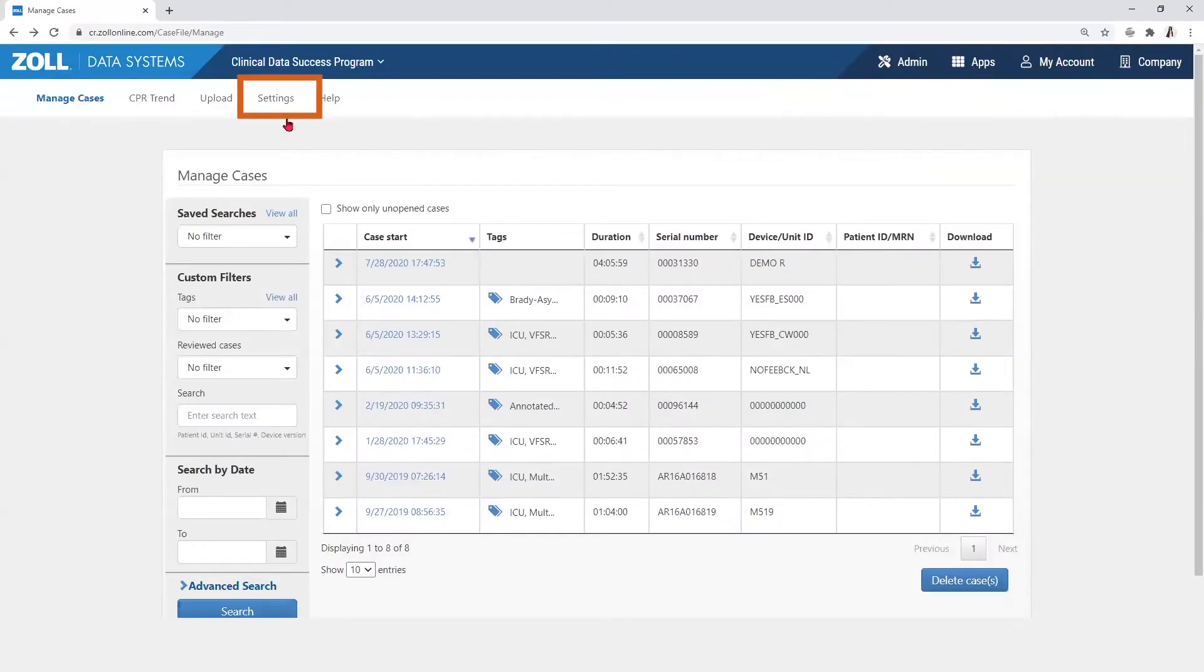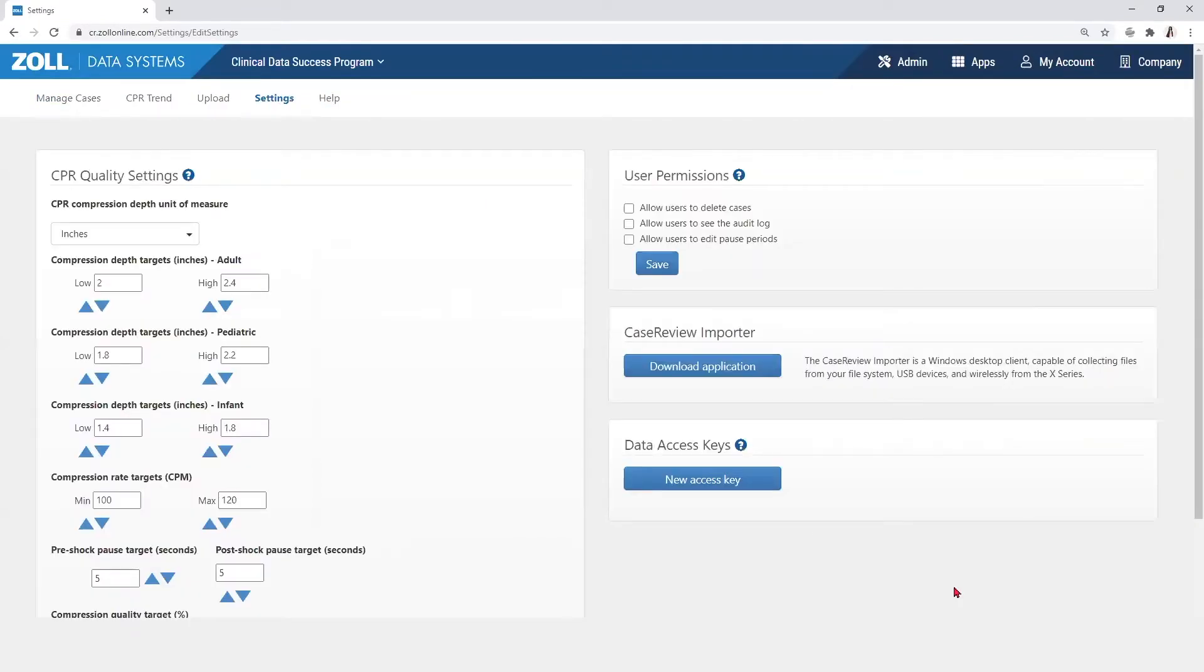The settings page is accessed by selecting settings in the top banner.